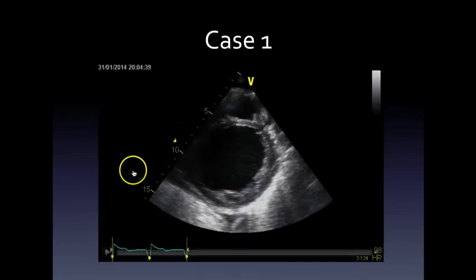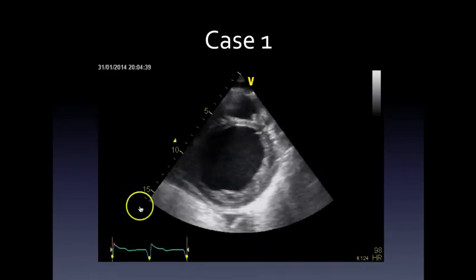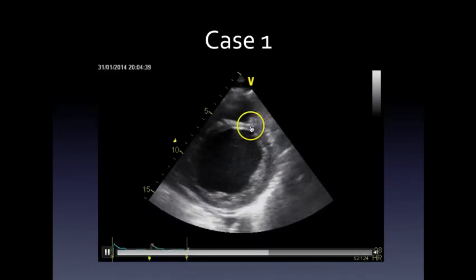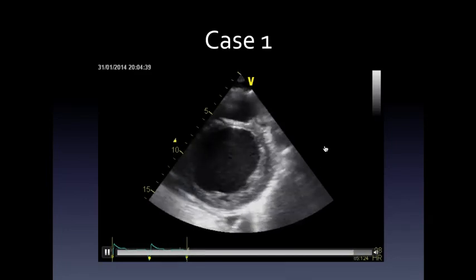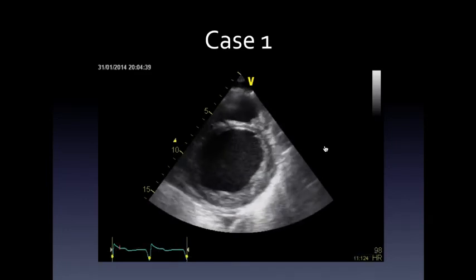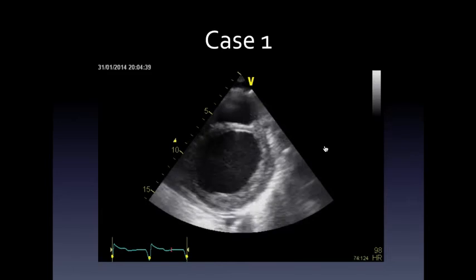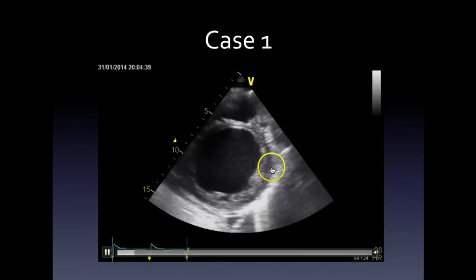So that is the parasternal long axis view. This is the, let's get my cursor out here for you guys. This is the parasternal short axis view. So shockingly bad, right? So really this lazy heart. Few comments on this. I didn't take this echo, one of my colleagues did and did a superb job. But there's a lot of brightness here. So the gains are actually very high in this.